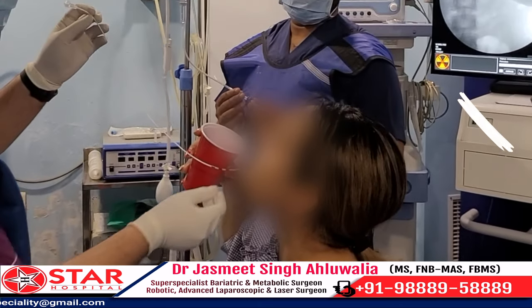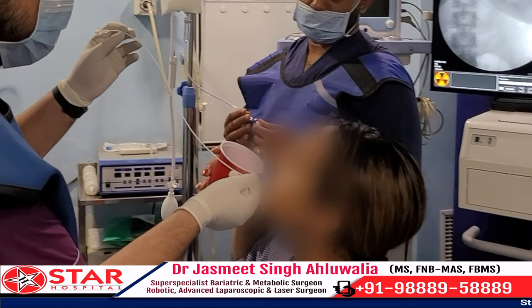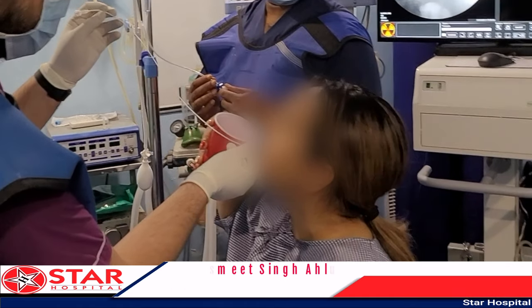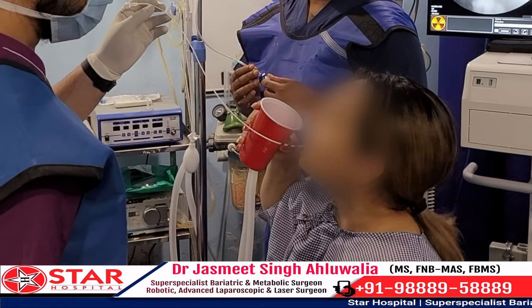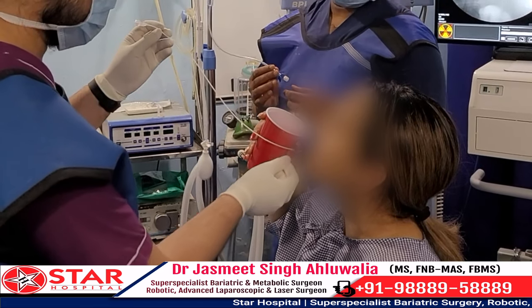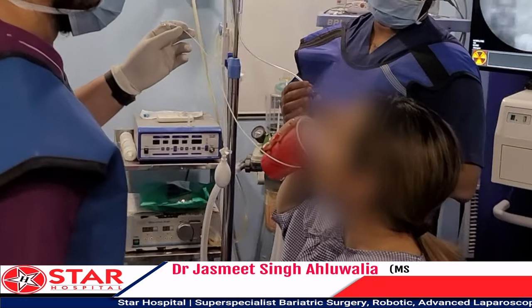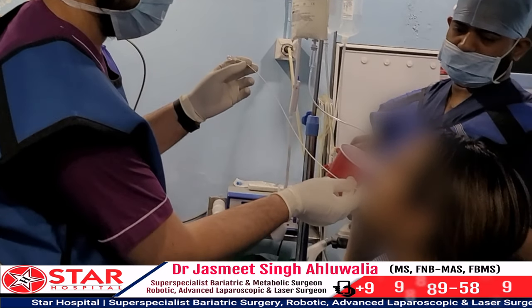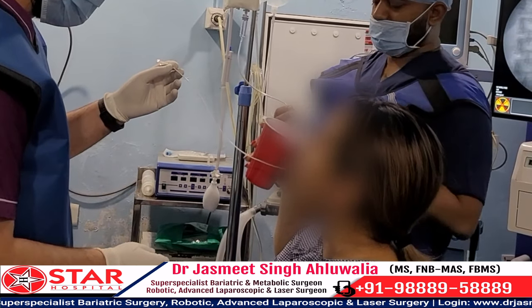You can also see a screen behind the patient which is showing the first X-ray taken before starting the procedure, so that once the balloon is inside the stomach we can repeat this X-ray to be sure that the balloon has reached inside the stomach, and then we can start inflating the balloon.